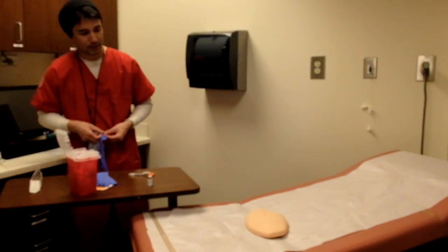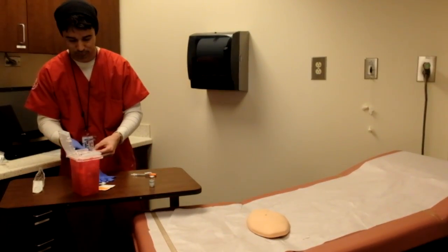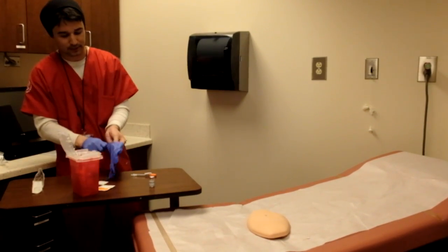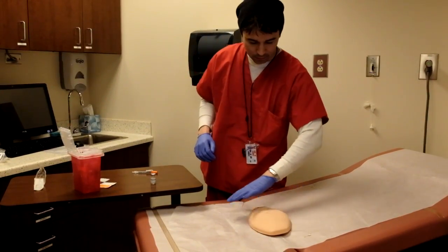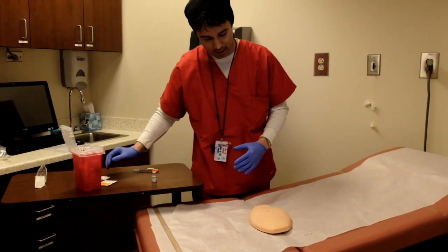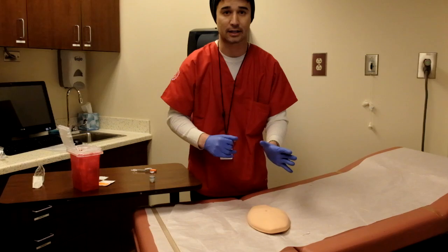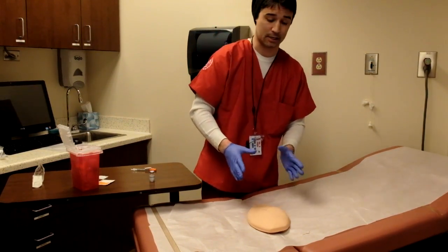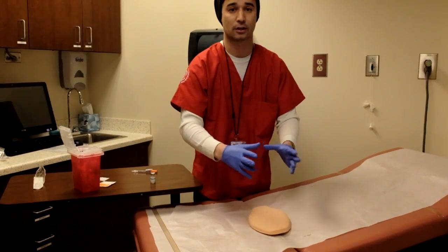At that point, we've already practiced our hand hygiene — glove up. We're going to get ready to do what we came here to do. We'll look at the abdominal area where we're going to give our sub-Q injection. We'll assess for any scarring, bruises, or rashes — those kinds of things — and we want to avoid those areas. We also want to stay about a one to two inch circumference away from the belly button area.